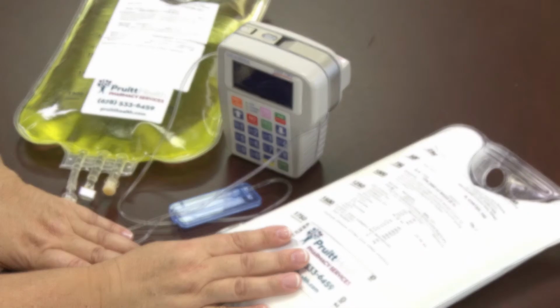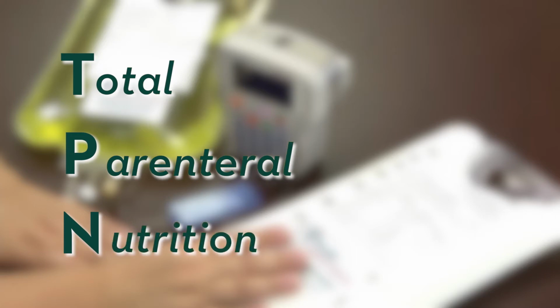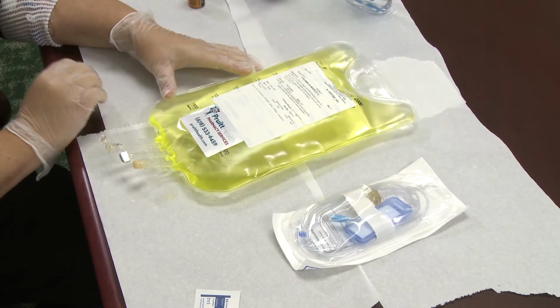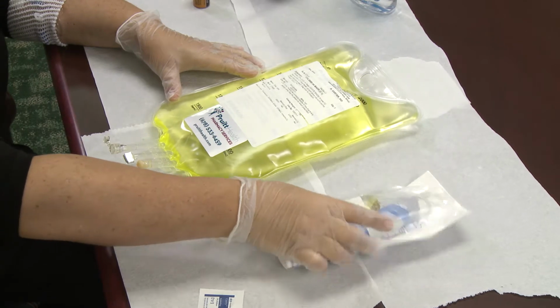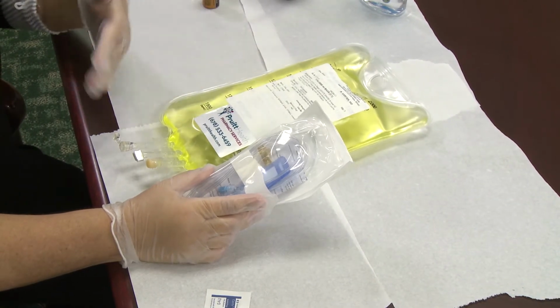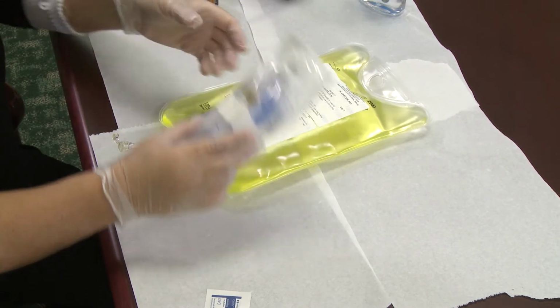So today we're going to talk about doing TPN in the home setting. TPN is Total Parenteral Nutrition, which is all of your food IV. Now we're going to talk about putting the tubing into the bag of TPN and getting the TPN to the end of the tubing.